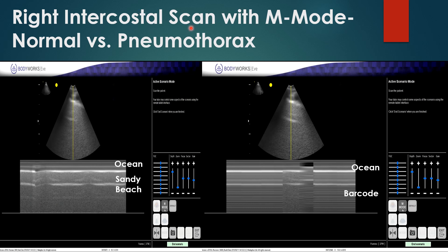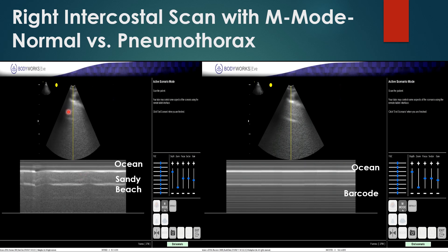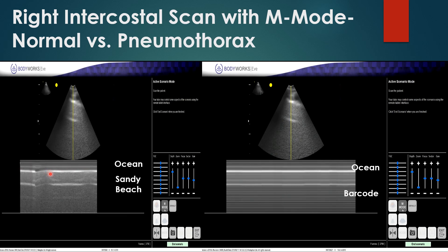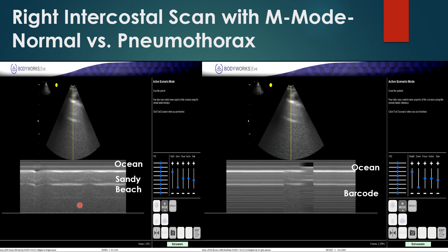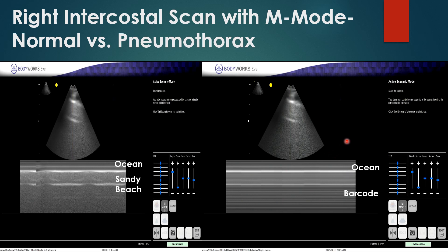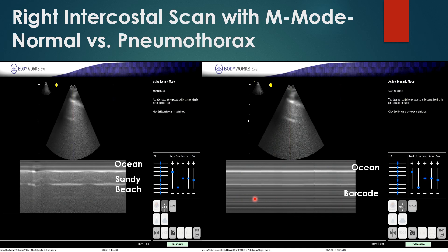For evaluating pneumothorax, in addition to standard 2D or B-mode scanning, you can use M-mode, where a slice is taken through the 2D image. In normal lung, you have the parietal and visceral pleura: above the pleural line you get an 'ocean' effect — stable with no real movement — and below it a 'sandy beach' pattern, which is speckled, indicating lung movement. In pneumothorax, you still have the ocean above the pleural line, but instead of a sandy beach, you get a 'barcode' pattern because nothing is moving — everything is stable and consistent.